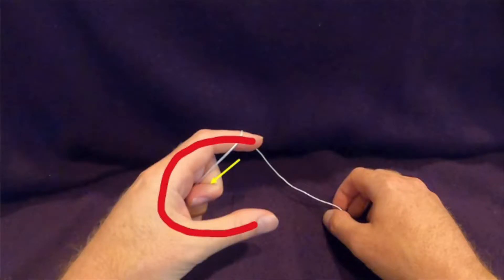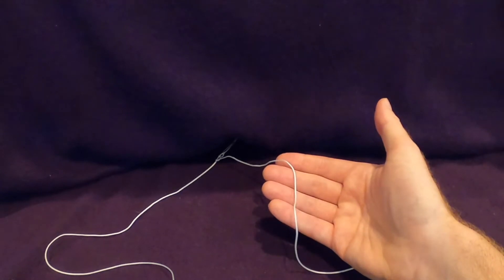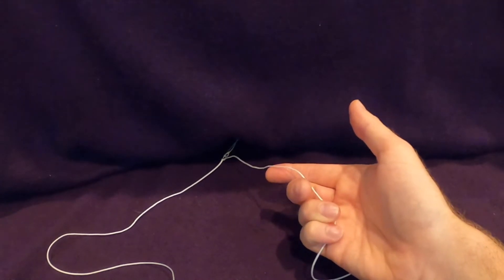Note the yellow arrow here points towards direction that the suture tail should point. It doesn't matter which hand is being used to tie the knot, the overall approach and starting position is the same.